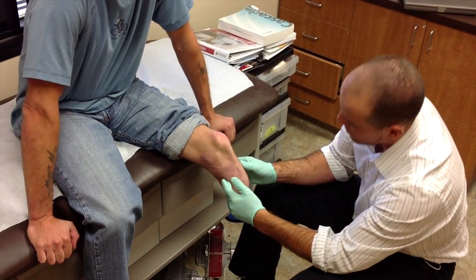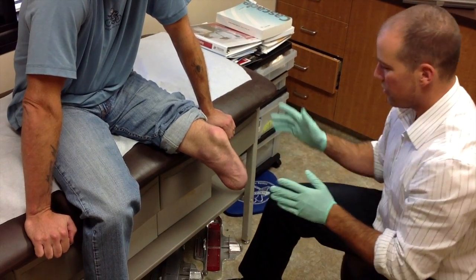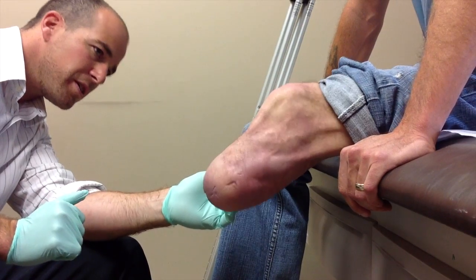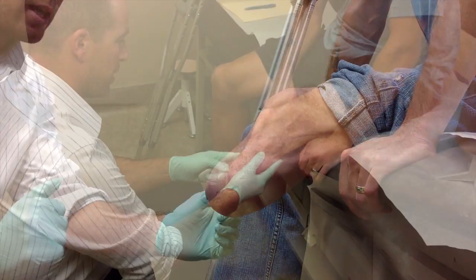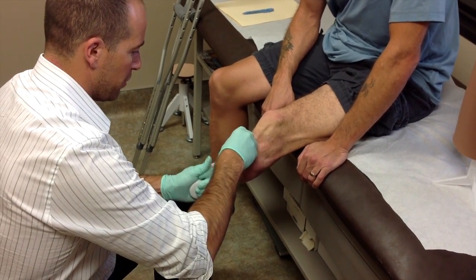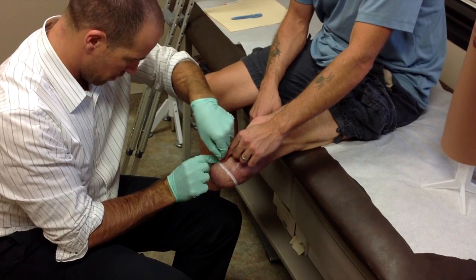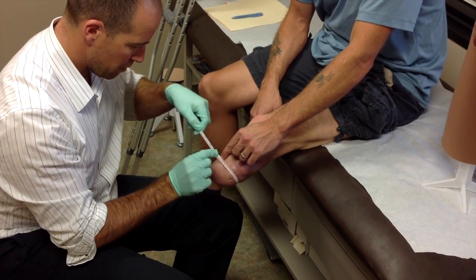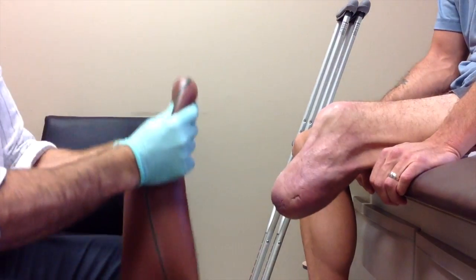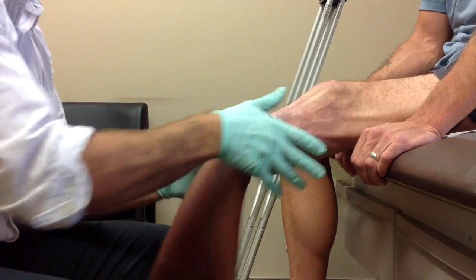The practitioner will take you back to an exam room and re-familiarize themselves with your residual limb, noting any areas where they'll want to pay special attention during the casting procedure. Typically, they'll take a measurement or two to obtain the correctly sized gel liner, and picking the gel liner from their stock, they'll work with you in applying the most properly sized gel liner to your limb.